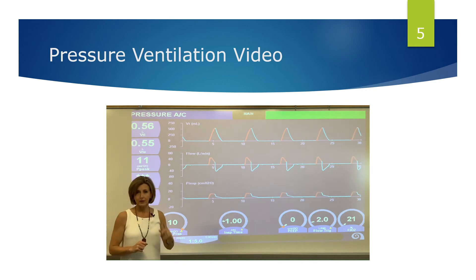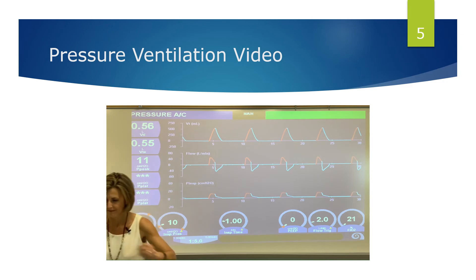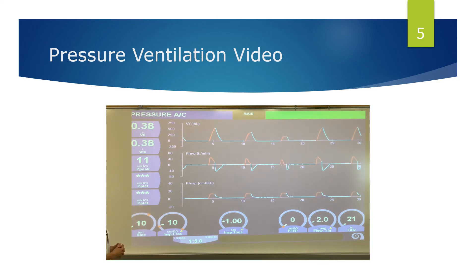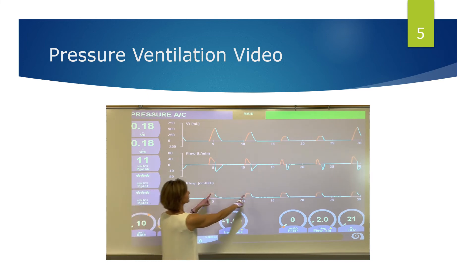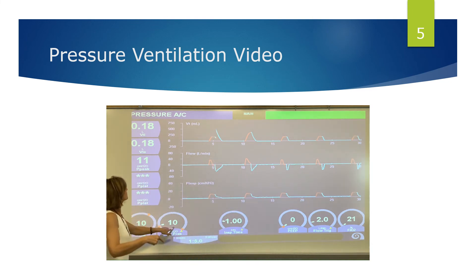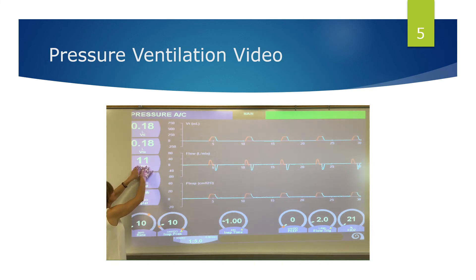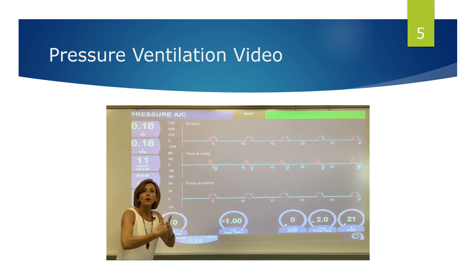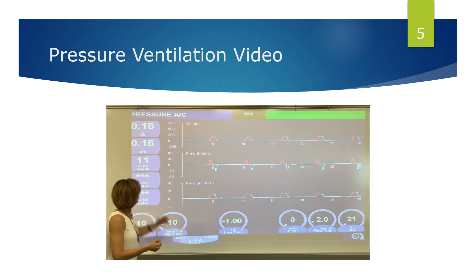Now I'm going to decrease compliance — I'm going to make the alveoli stiffer. Looking at the graphics: pressure didn't change, but look how tidal volume decreased. We still have that same 10 centimeters of water pressure set, but look at tidal volumes now — when the lung got stiffer, the machine couldn't move as much volume per unit of pressure. So when we set the pressure and the lungs get stiffer, tidal volume decreases.